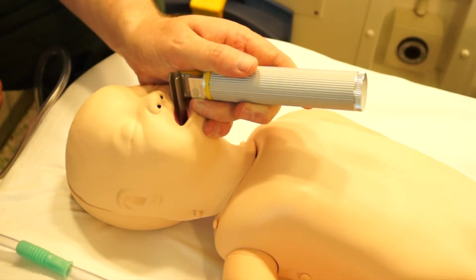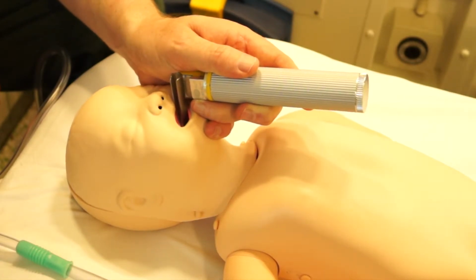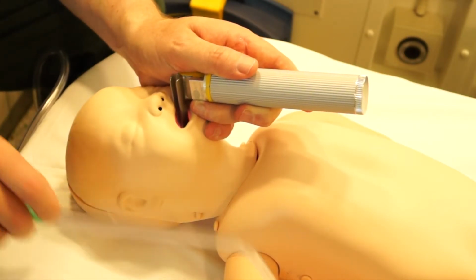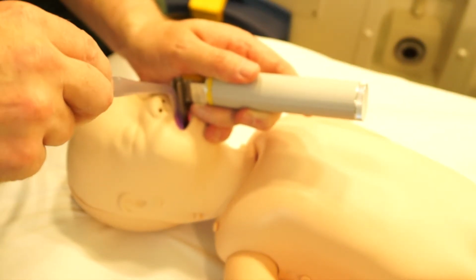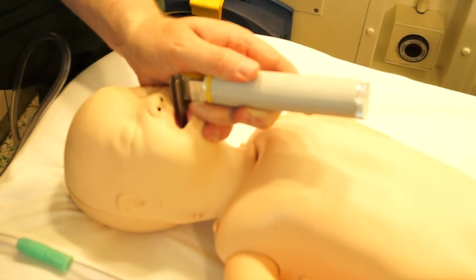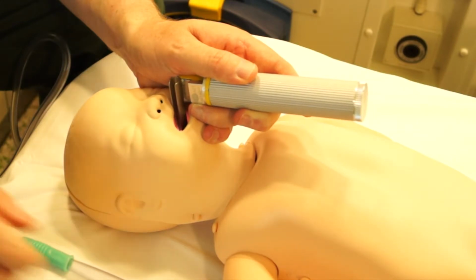Next, under direct vision, inspect the oropharynx. If there are any obvious obstructions, such as thick particulate meconium or blood clots, you could consider suction at this point. Whilst in this position, you could also consider inserting a correctly sized OP airway.